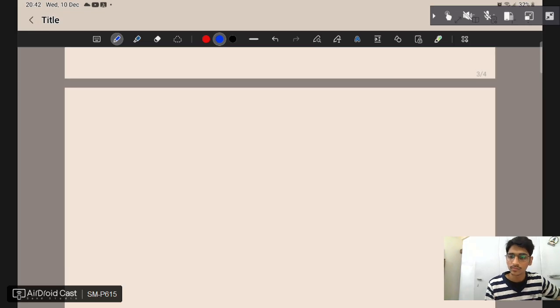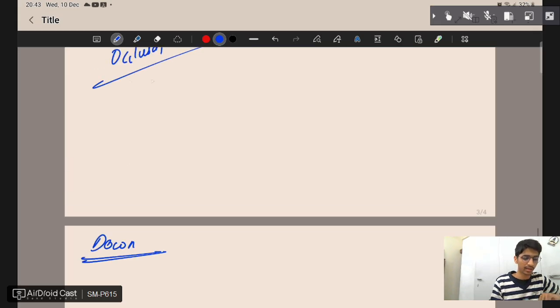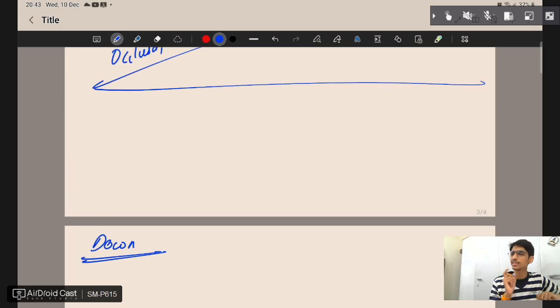It's already been half an hour. Now we are going to start our first analysis. Basically, what is Downs analysis? But before Downs analysis, there is one last topic, which has also been asked in exams many times.